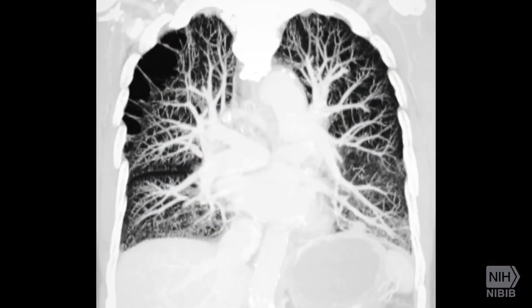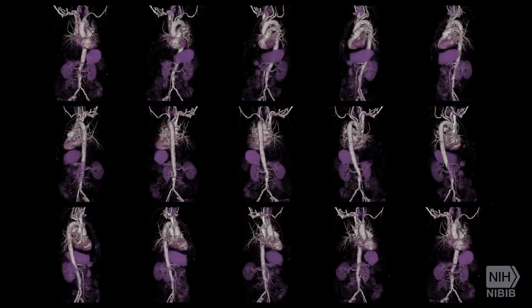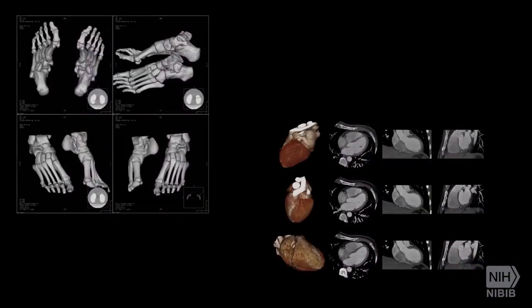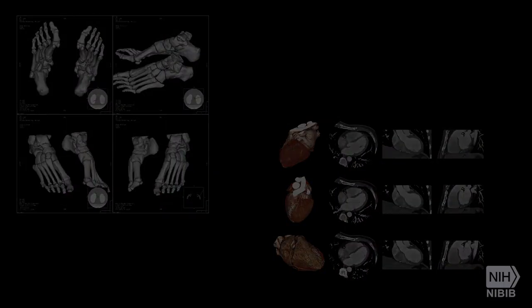CT images are more detailed than conventional X-ray images. An X-ray image of lungs appears on the screen, followed by a series of more detailed CT images of the lungs and heart. CT scans can reveal bones as well as soft tissue and organs. A set of CT scanned bones appears next to CT scanned images of heart tissue, then fades to black.